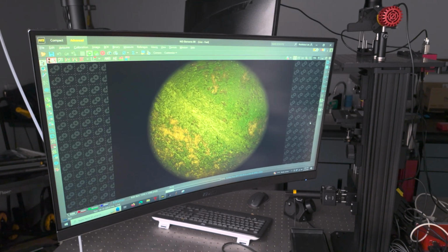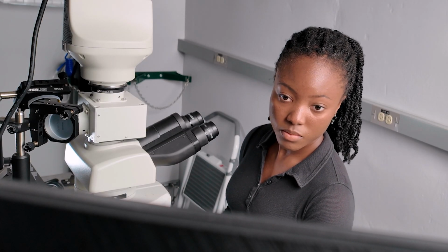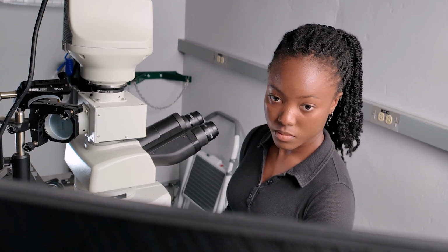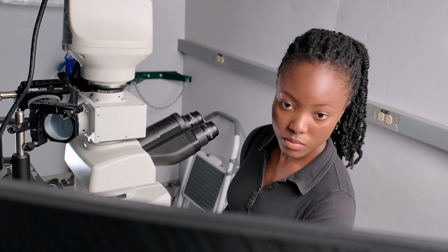You just use a slide with a butterfly wing on it. Cut out a wing, put it on a glass slide, interfaced with a tissue sample. I don't have to do anything else really. You just need a simple setup. So we're not changing the optics or the equipment, but we're using the nanoscale science of light to create a surface that allows us to assess the tissue.